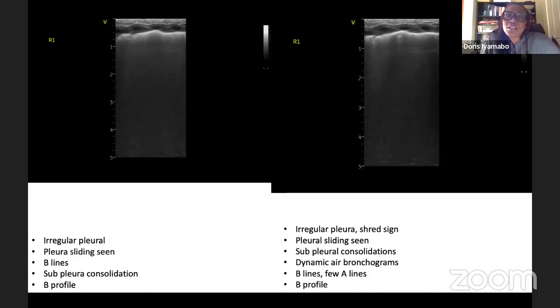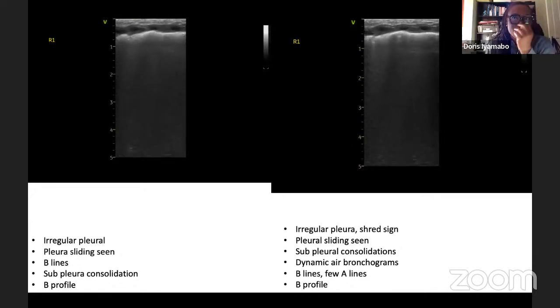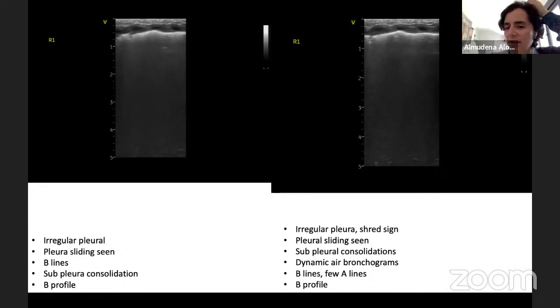Unfortunately, I didn't do an ultrasound much earlier on to see the transition, but these are the images. I did it because of the rising oxygen requirement, and I did it before an X-ray, because I said, let me see what the lungs look like. I do agree, it seems like whiteout, dense B lines, which I found really puzzling at this age, 37 days old, corrected to 29 weeks. Yeah. Okay. That's an evolving BPD.